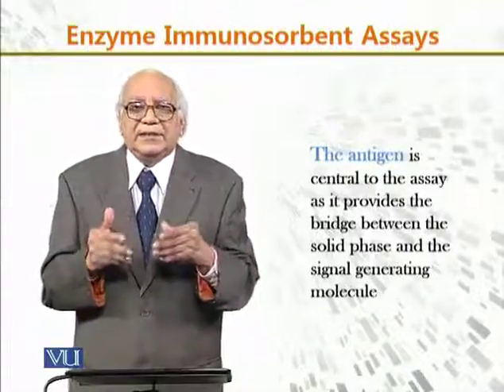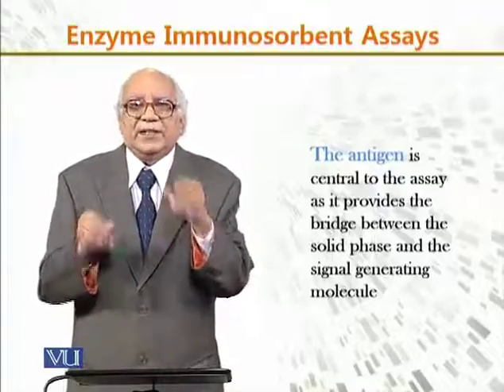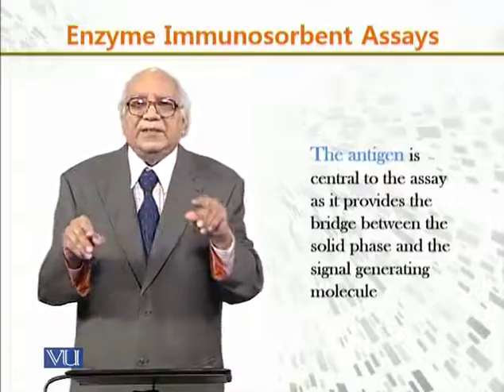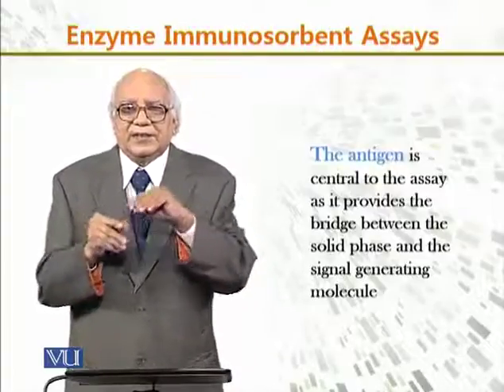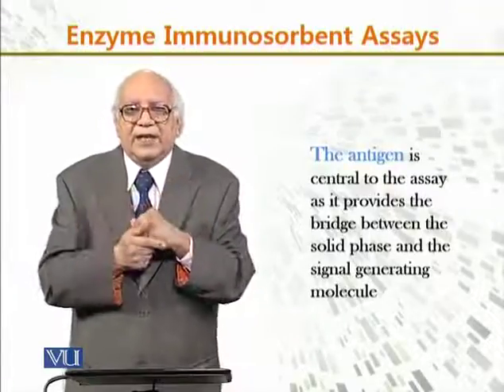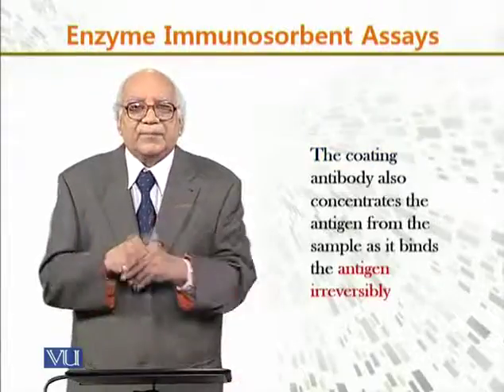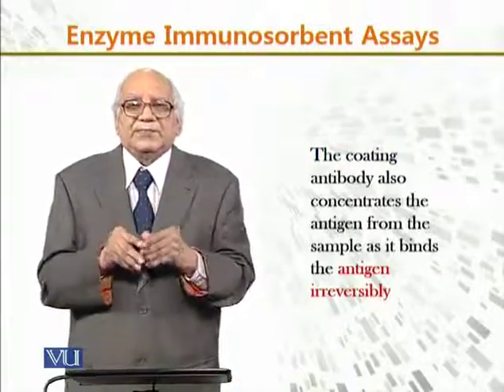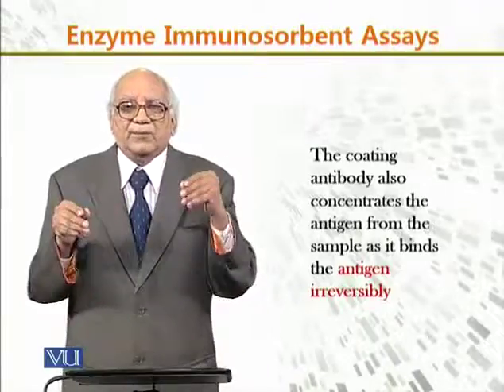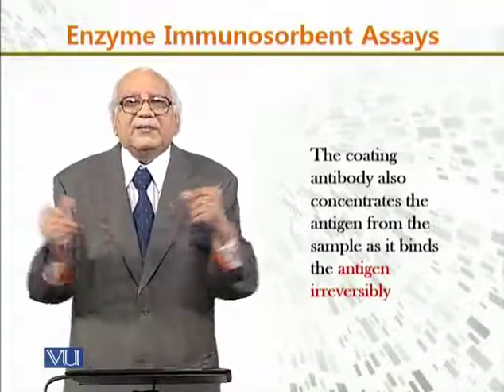The antigen is central to the assay as it provides the bridge between the solid phase and the signal-generating molecule, and it is the antigen that is to be measured. The coating antibody also concentrates the antigen from the sample as it binds the antigen irreversibly.